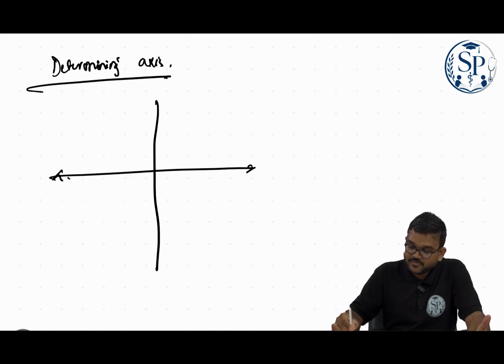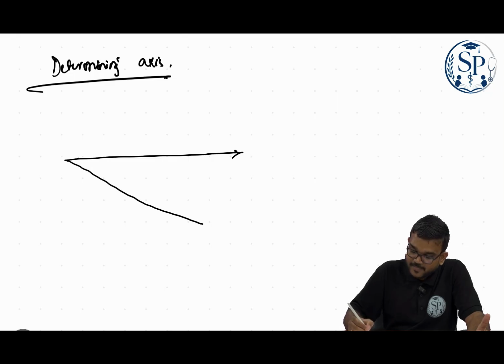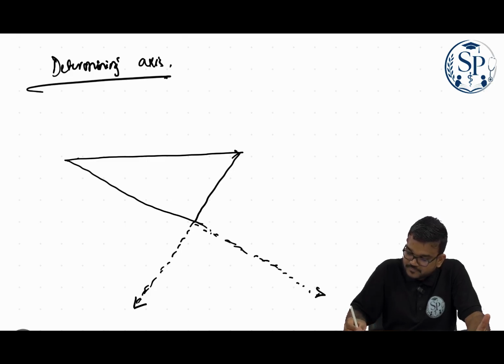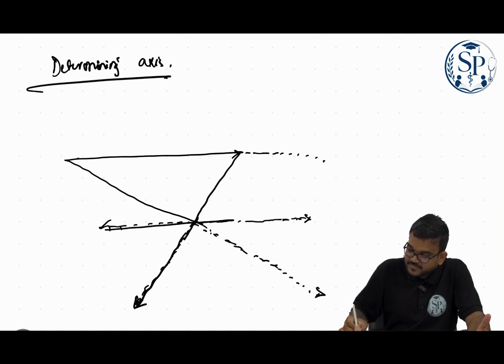So before that I want to draw that diagram again. This is lead 1, right? This is lead 2, this is lead 3. Okay, if you extrapolate this diagram, it looks like this. So now you can join the dotted line forming the hexaxial system.